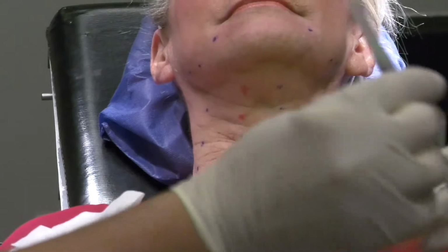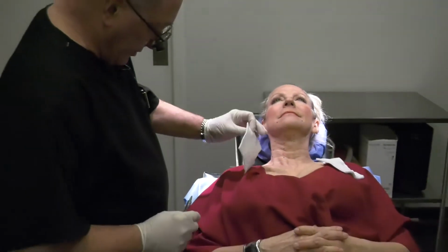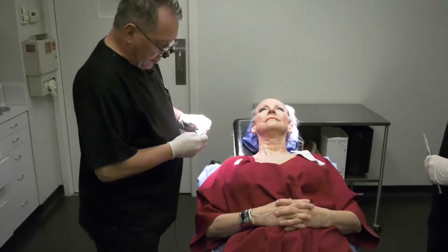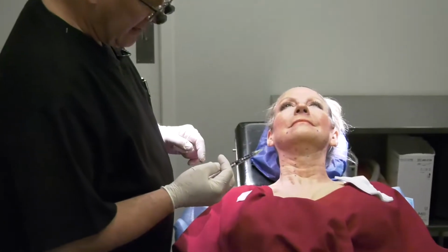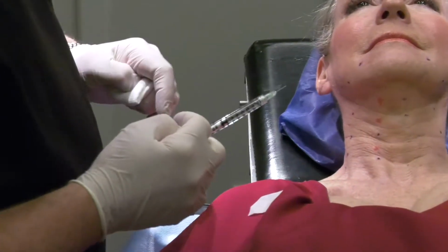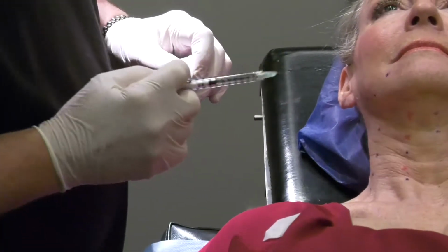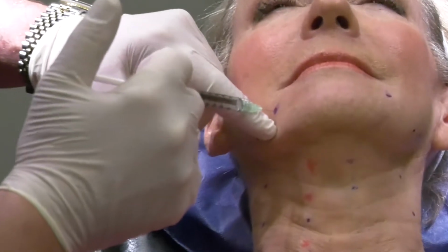So we'll start with, and you can start either way. I will start with the face has been prepped before. I like to start with the DAO, and again, in this particular dilution, 0.1 cc is a 4-unit injection, and 0.05 injection is a 2-unit injection. We'll start with the DAO.